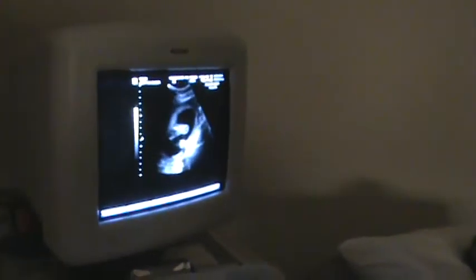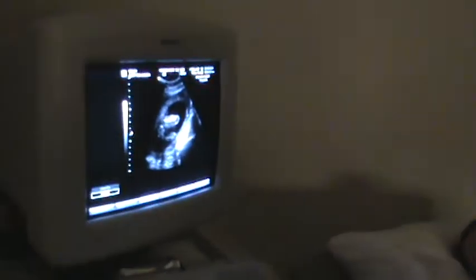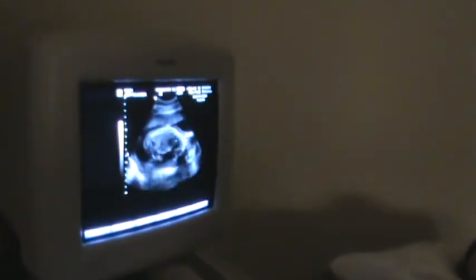This is baby's thigh bone or femur length. Femur is the longest bone in the body, so we don't like to have short long bones. If that bone is appropriate, all the bones are normal. It comes out to be 20 weeks even — beautiful. So it rules out dwarfism, it rules out skeletal dysplasias. A soft marker for Down's Syndrome is short long bones. Just like that crib position.